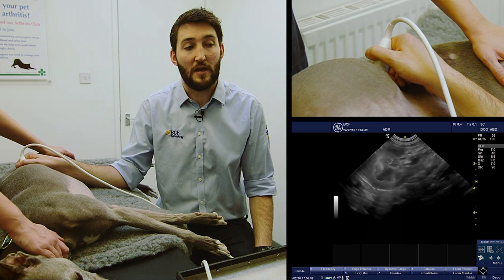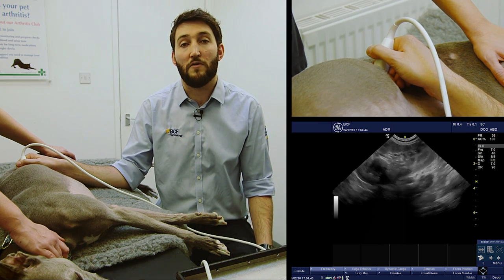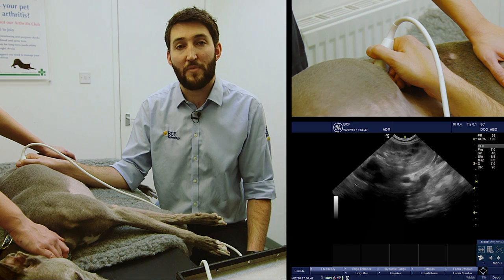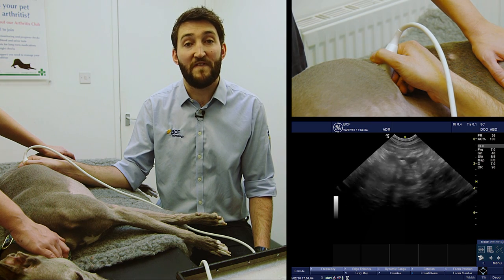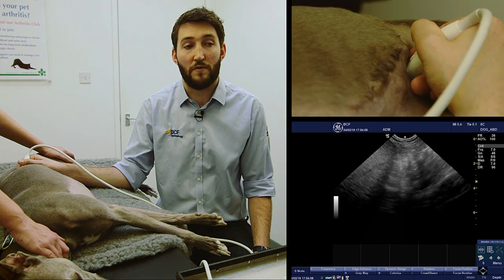We're going to locate the left kidney. If you're not sure how to do that, feel free to take a peek at our earlier video covering scanning of the kidney just to remind yourself of the technique. Once we've got the kidney on the screen, all we're going to do is make a small fanning movement — we're going to fan dorsally off the dorsal border of the kidney.